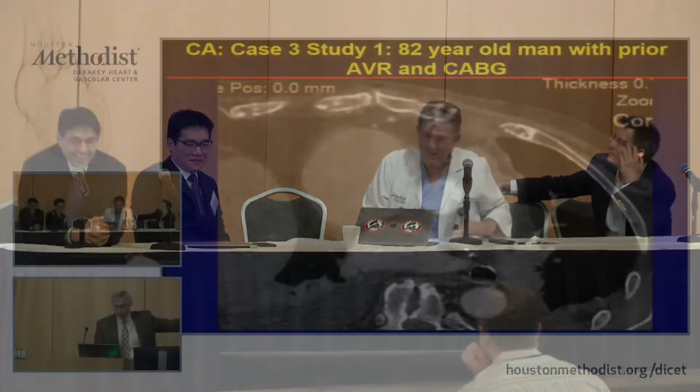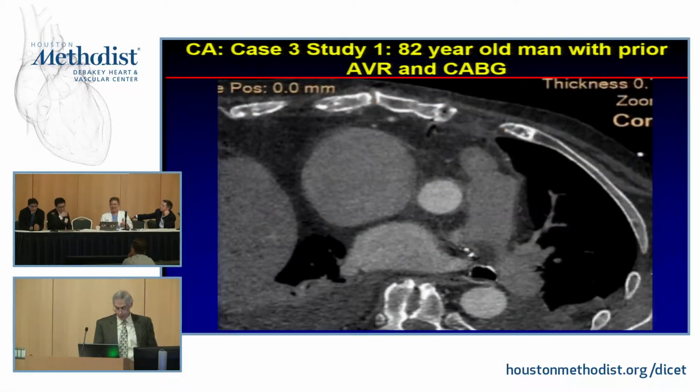Get ready. Case 3. All right, case 3. Look at this. Tell me about this.